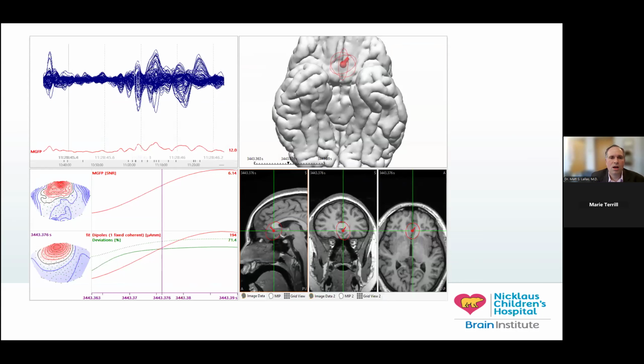So here's a patient who was seen and ended up having intractable epilepsy. The seizures were quite frequent, and on the initial MRI there was not a lesion identified. So in part of the planning to move forward, we did plan for the updated MRI, the high density EEG with the phase one, with a PET scan. The high density EEG we do as a brief test. It's not a prolonged test.